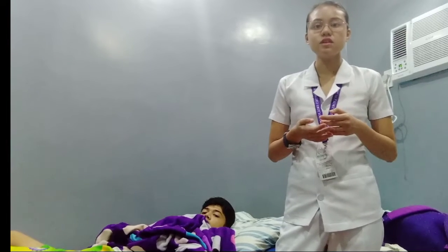We need to shift the patient's bed linen to expose only the potential injection site, inspect the area for bruising, inflammation, and edema, again to avoid any bacterial or contamination affecting the medication and syringe. Best sites are located at the outer aspect of the upper arm, the abdomen, below the costal margin to the iliac crest, or the anterior aspect of the upper thigh.